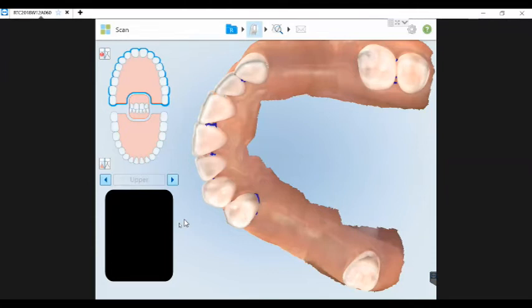Ideally, I like to build up, well, let me take a step back. Typically, the tooth that's getting a crown under an existing partial is broken, and that's why it needs a new crown. Or there was tremendous decay under an existing crown. So I like to build it up with a little bit of composite, place the partial over top of that composite when it's still a little tacky to get an imprint of the clasp or rest seat from the partial, and scan, take the partial out of the patient's mouth and scan that mock buildup with composite as the pre-treatment scan. And then I ask the lab to duplicate the crown with the anatomy from that pre-treatment scan.